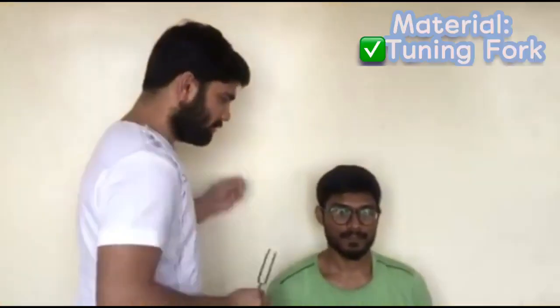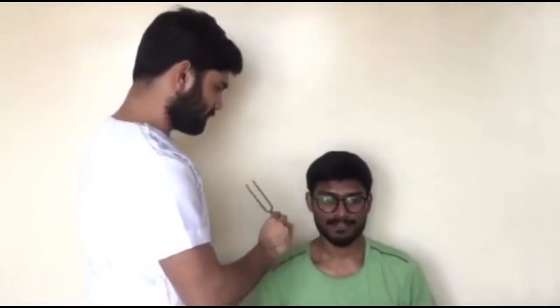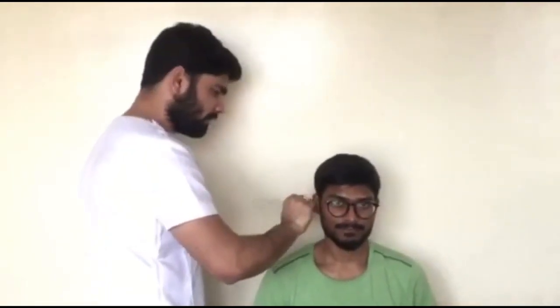Rinne test is used to evaluate hearing loss. It further helps us to differentiate between air conduction and bone conduction. Let me know when you stop hearing vibration. Stop. Stopped. In which position do you hear louder noise?